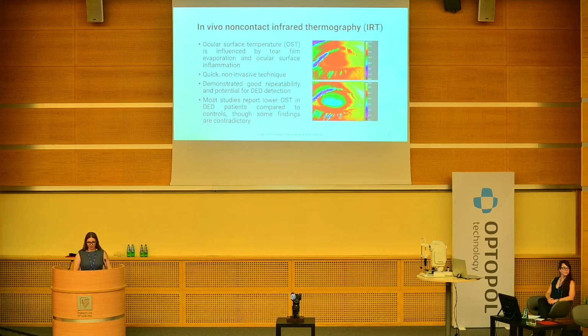So one of the things that we tested with my group was infrared thermography, like Pien has already been talking about. It's pretty nice because during our research we were thinking it would be perfect to be able to follow temperature and tear film stability at the same time, which you did.